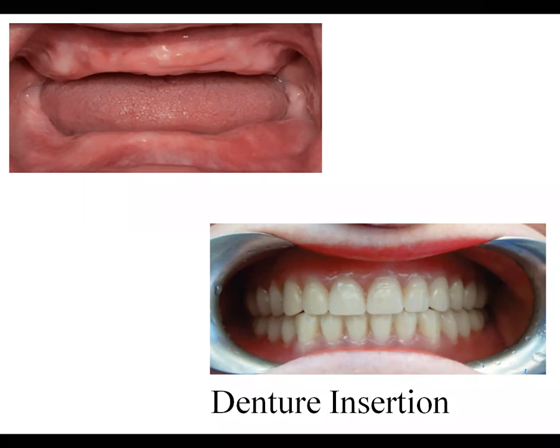Starting from history taking, Rajra sir will take history, or he will take half of these steps. I will take the other half, or I will continue all these steps, from your primary impression to your denture insertion. Making of primary impression, secondary impression, recording of jaw relation, the trying process, the denture insertion process.